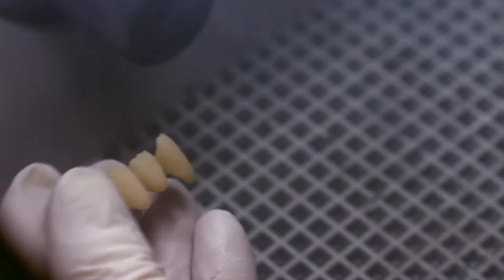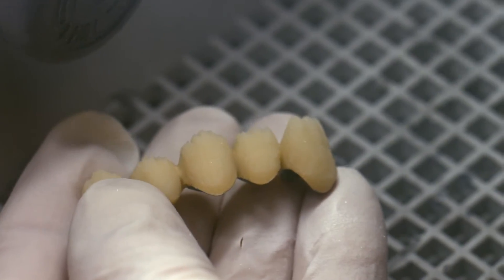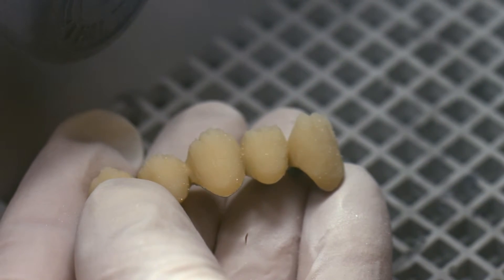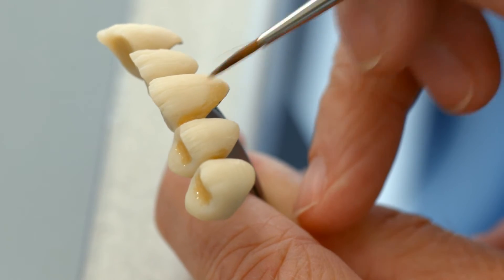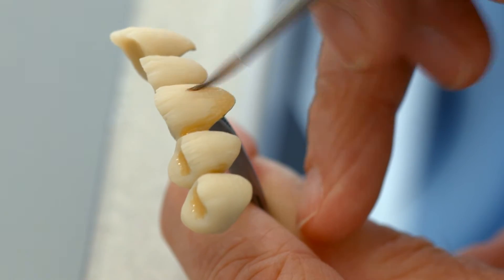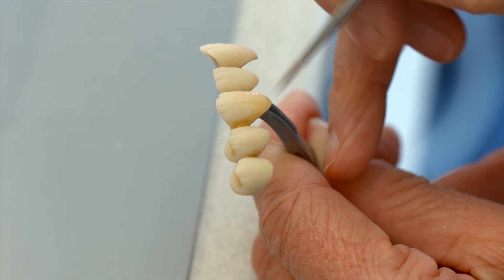Carefully sandblast the areas to be built up with 80 to 100 micron aluminum oxide at maximum 1 bar pressure. You may then characterize the bridge with suitable SR-NEXCO stains and SR-NEXCO effect materials. The dentin surface does not have to be pre-treated.